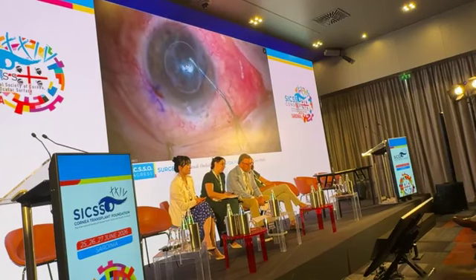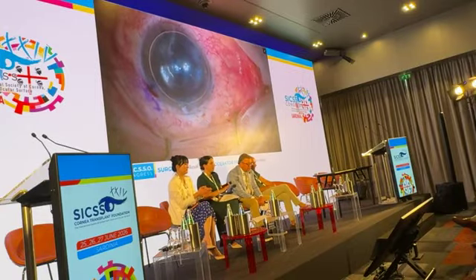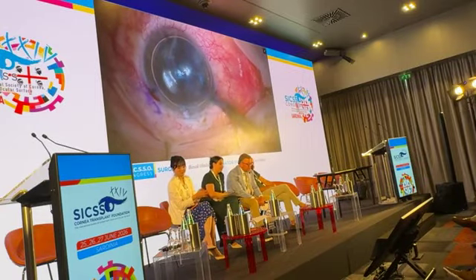Is it air? It's not gas. No, he is not using gas, he is using air. So very good. You can see that the graft is perfectly in position.